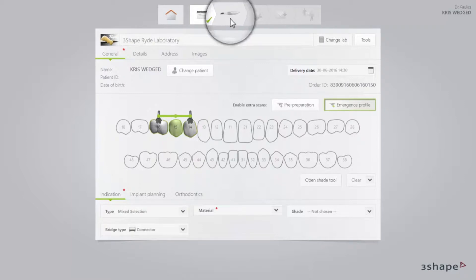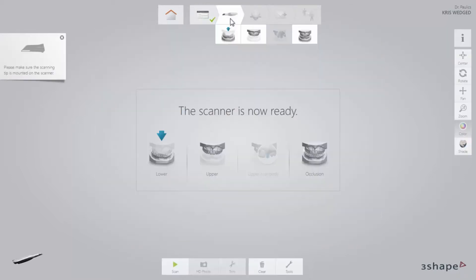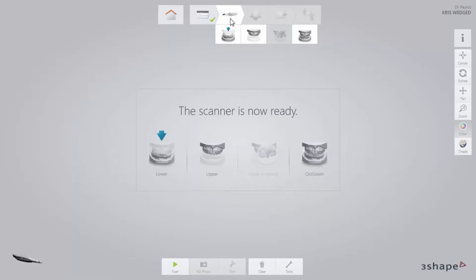Now proceed to the scan page. You will have four scans to do: lower arch, upper arch with emergence profile, upper arch with scan bodies, and occlusion.